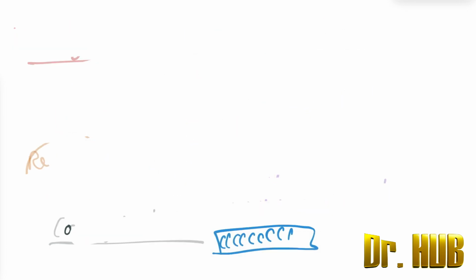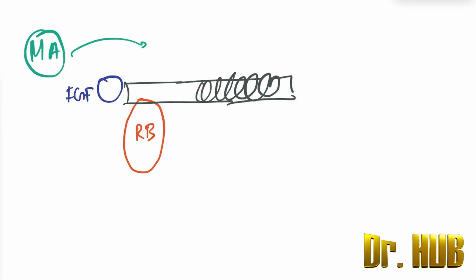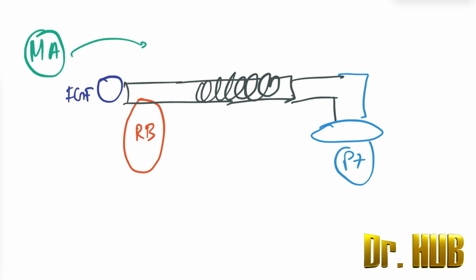So now let's look at the Mapleson A. How does the MA, that is the Mapleson A, look? Let's draw the diagram. We have the reservoir bag, and just beyond this we have the FGF. Then we have the tubing, where the corrugated tubes are present. Then comes the way to the patient. Between the corrugated tubes and the patient there is the APL. So this forms the Mapleson circuit A. The FGF is near the bag, whereas the APL valve is near the patient. Hope it is very clear.